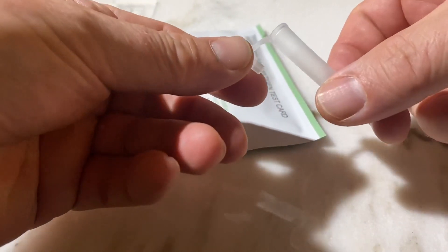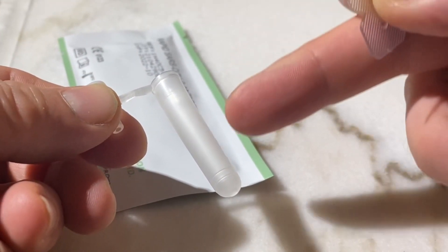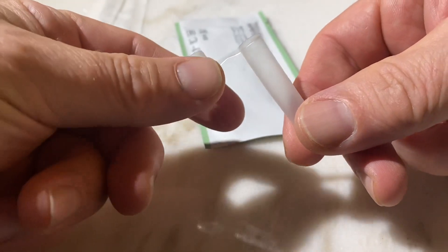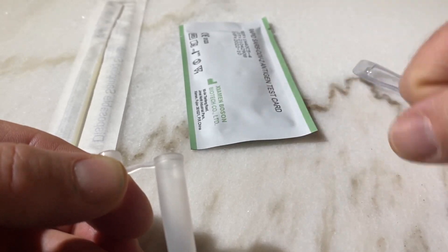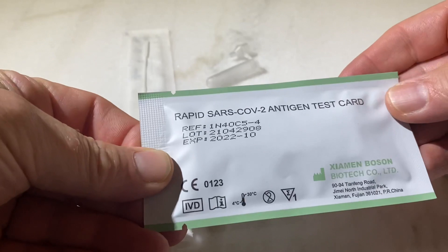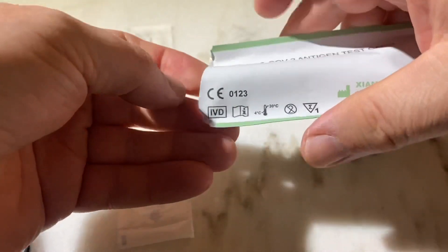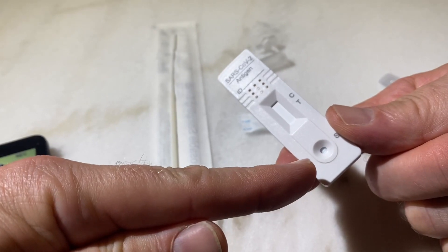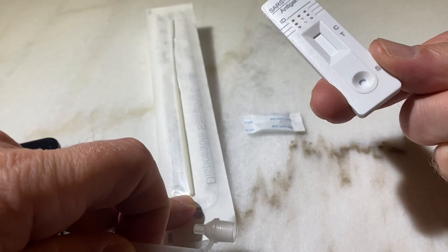This is your container — this is where you're going to carry out the test. This is your testing solution: it goes into that container, and then you're going to dip the cotton swab into the solution for one minute after having the cotton swab inside your nose. Then you test it on this piece — the testing specimen. If we open this one you'll find the SARS-CoV-2 antigen test card, and that's where you put the droplets of your solution after you've immersed the cotton swab that's been in your nose.